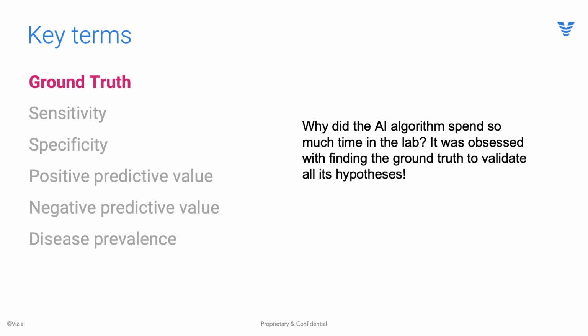So in the case of LVO, could it have been seen by a number of radiologists looking at the same image or not? That would be establishing the ground truth via a multi-reader study. And that's usually a yes or no. So it's not usually one reader, but multiple readers to establish that ground truth on a particular algorithm. That is our holy grail that we're trying to match our algorithm performance against today.